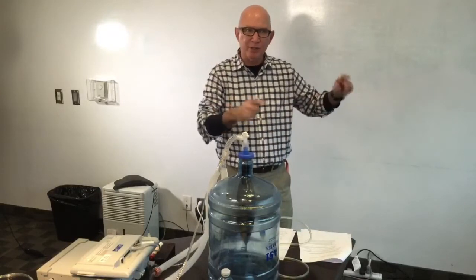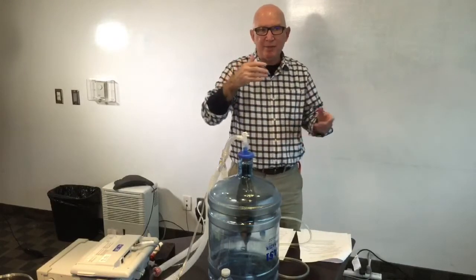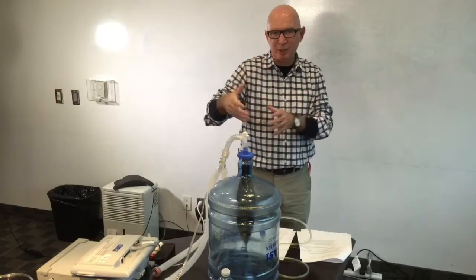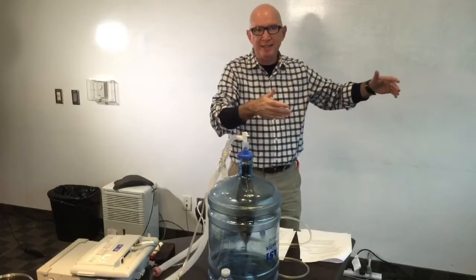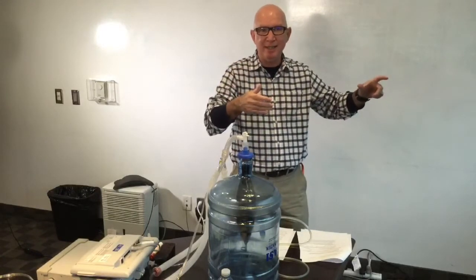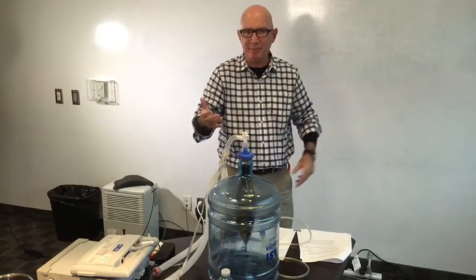So if your concern is that in assist control you're going to stack breaths because you're giving them the same volume on every single breath, if you're also setting up your pressure support on those spontaneous breaths with the same 6 to 8 mils per kilogram, then really 30 breaths per minute of AC at 6 to 8 mils per kilogram should look the same as 30 breaths per minute of 18 of them AC with 6 to 8 mils per kilogram, and the other 12 of a spontaneous breath with 6 to 8 mils per kilogram. The volumes are the same.